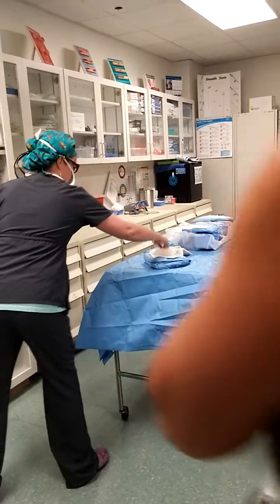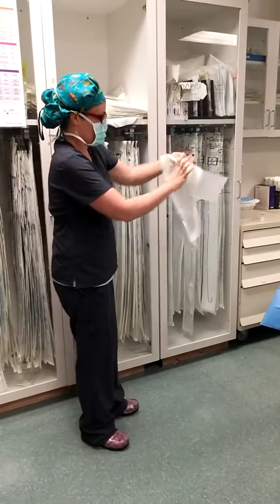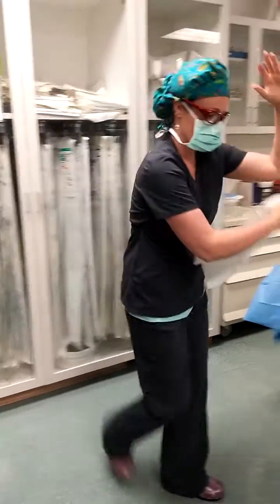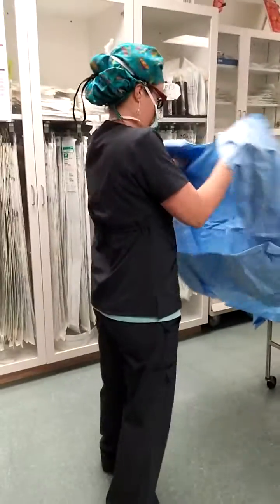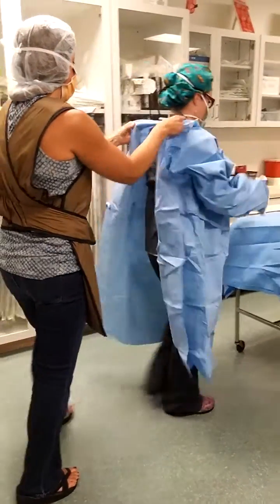Scrubbing, two to five minutes. Alright. Okay, dry, dry, dry, dry. I'm just going to throw it away with the same hand. Okay, you guys know this.